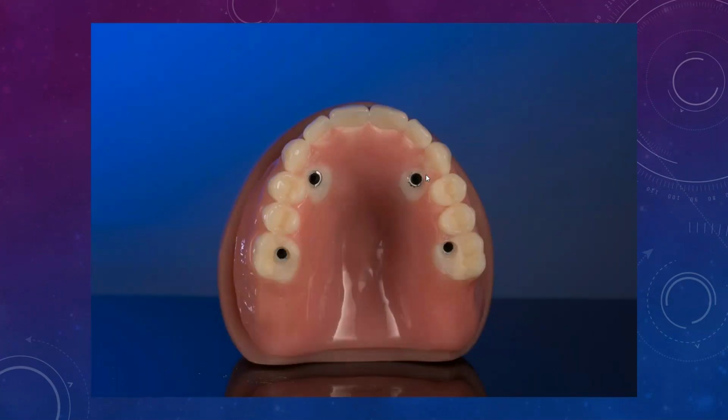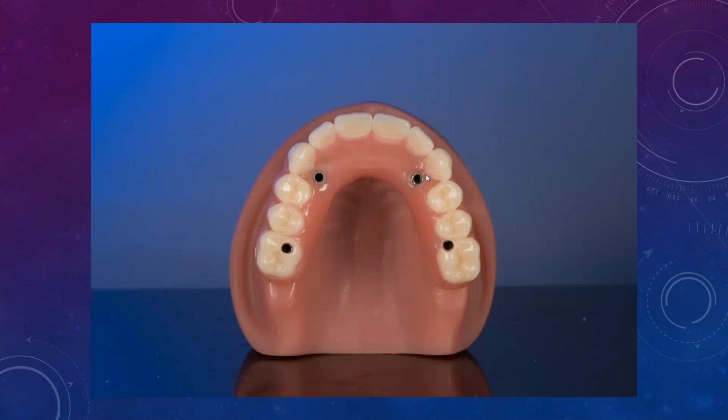Okay, so it looks something like this when you pick up the cylinders. Now what you basically need to do is cut everything back. Make sure you don't have any cantilevers. Like half a tooth is okay, but in some cases, people will actually cut that part as well. And then you want to make sure that you reduce your cusp height on your dentures, because you don't want too much lateral force on your implants while the patient is functioning, because it could lead to implant loss.